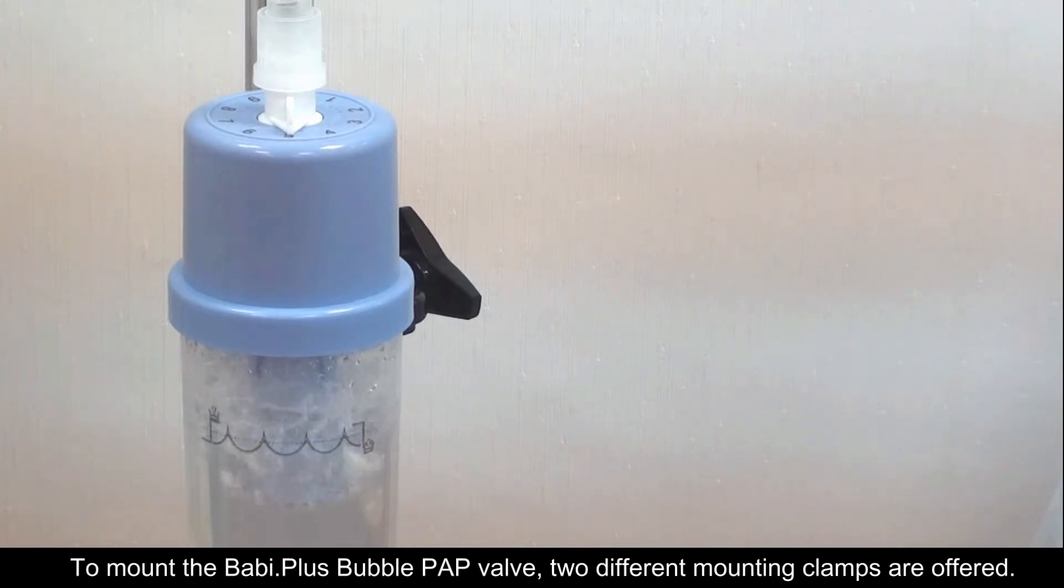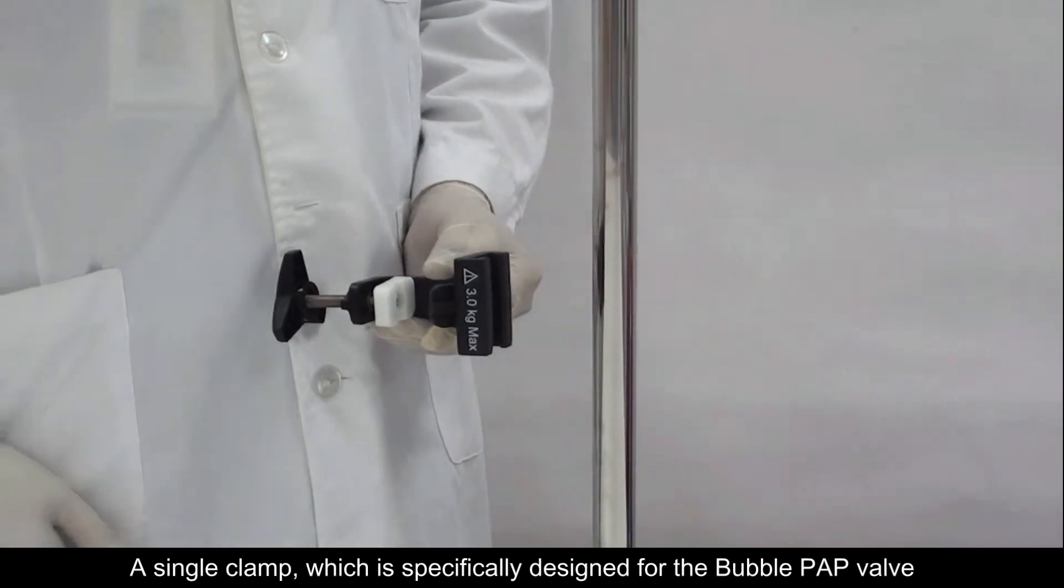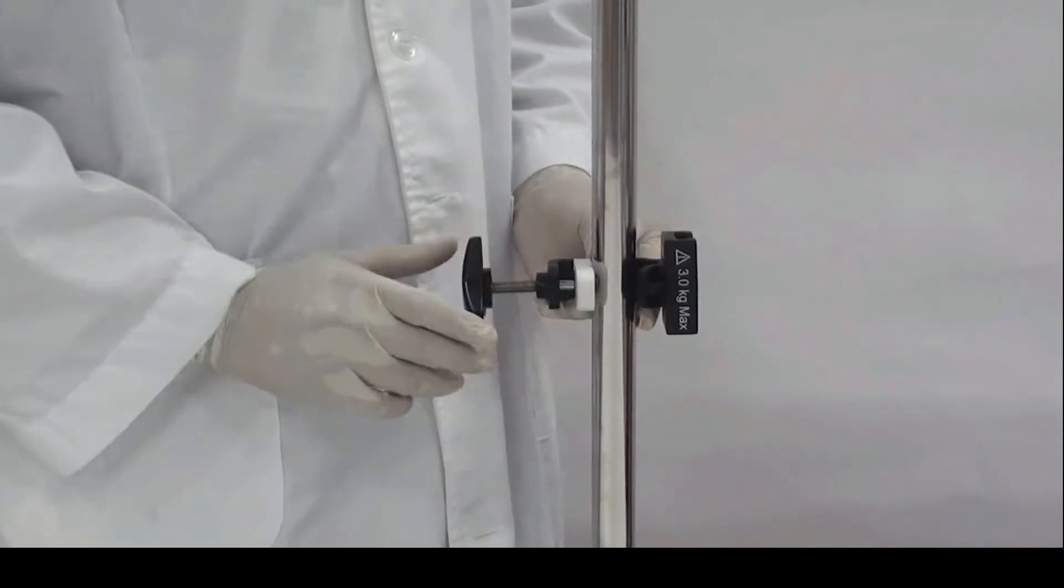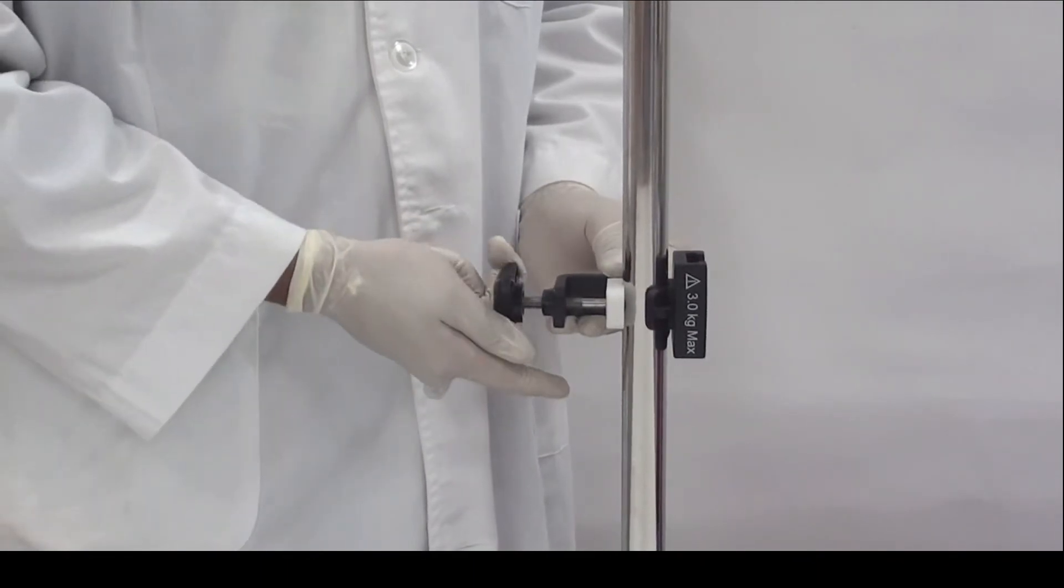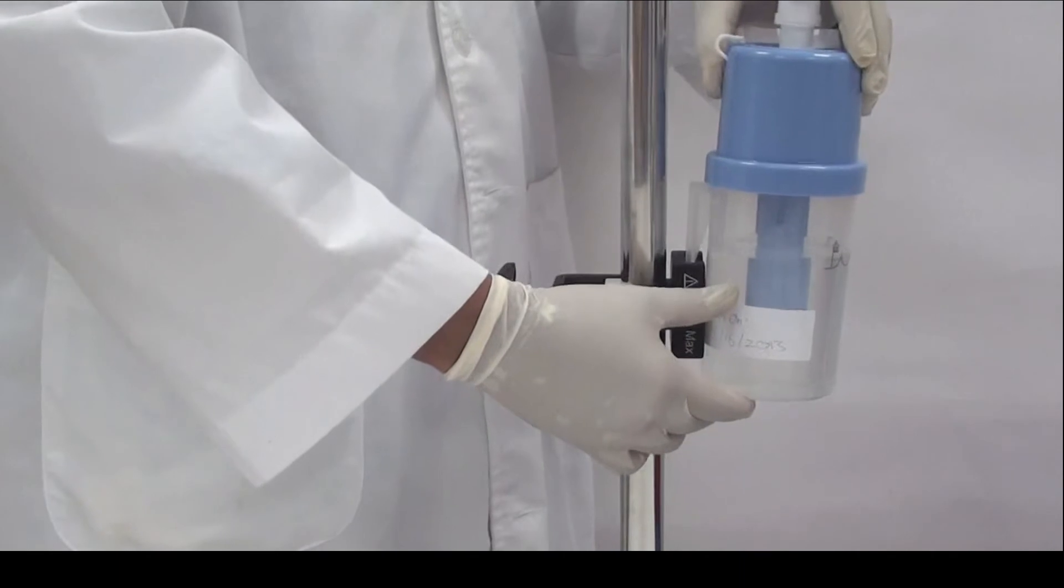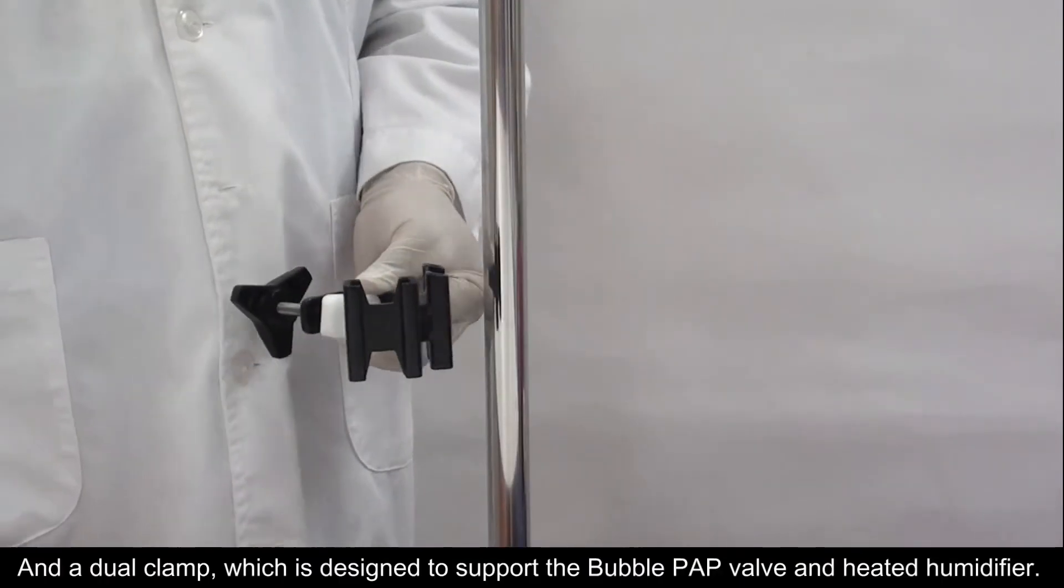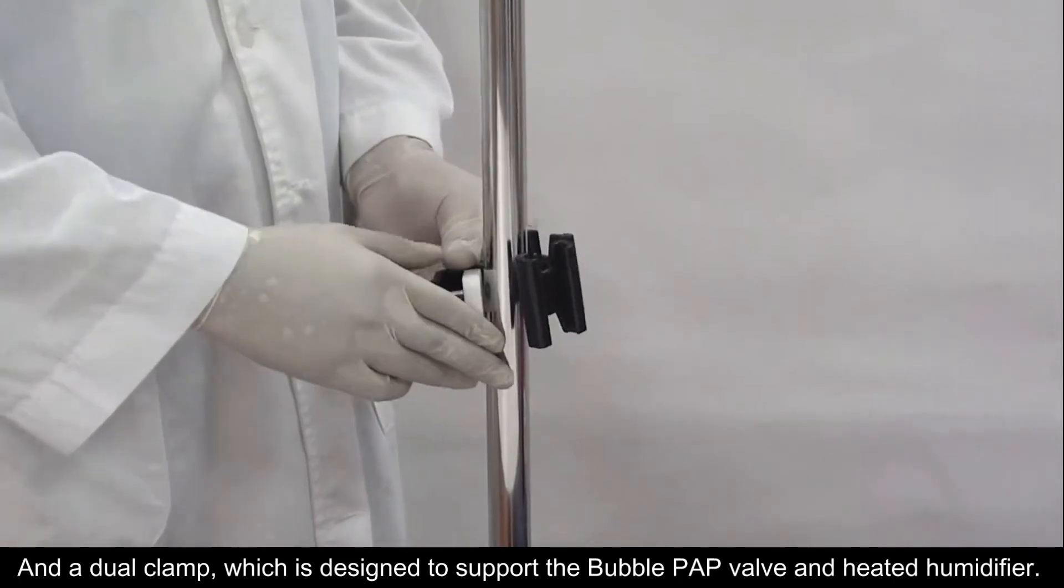To mount the Babi.Plus Bubble PAP valve, two different mounting clamps are offered: a single clamp, which is specifically designed for the Bubble PAP valve, and a dual clamp, which is designed to support the Bubble PAP valve and heated humidifier.